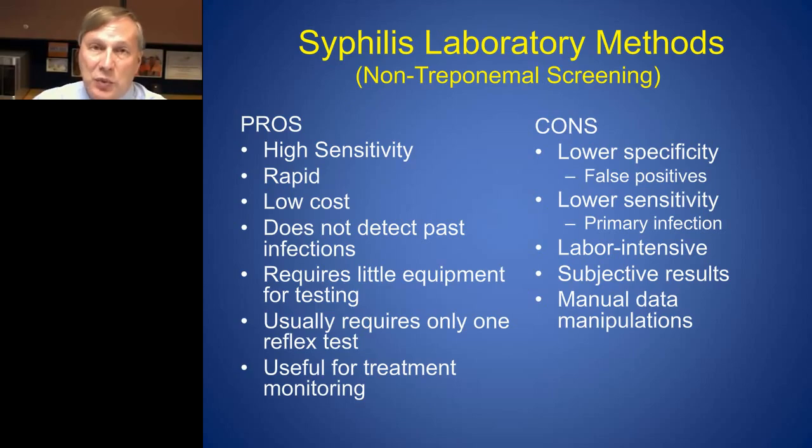It usually requires only one reflex test. As we know, you do an RPR, you go on to a treponemal assay, and usually that gives you some kind of an answer to take some kind of an action. And it's useful for treatment monitoring. Again, we want to look for that antibody titer to be going down with treatment.